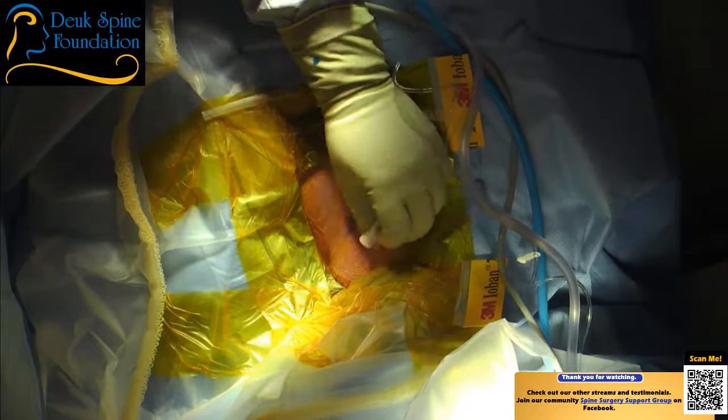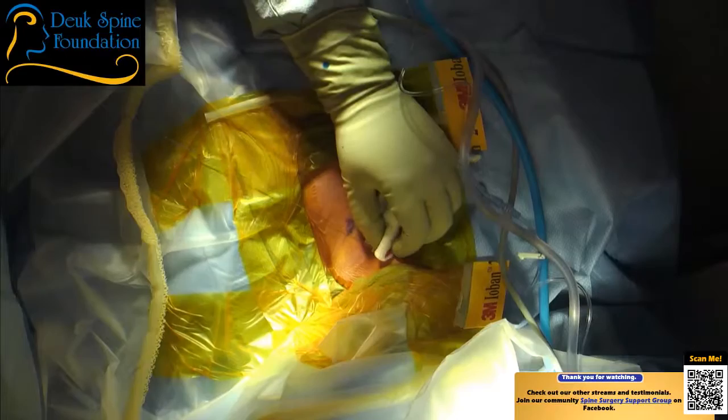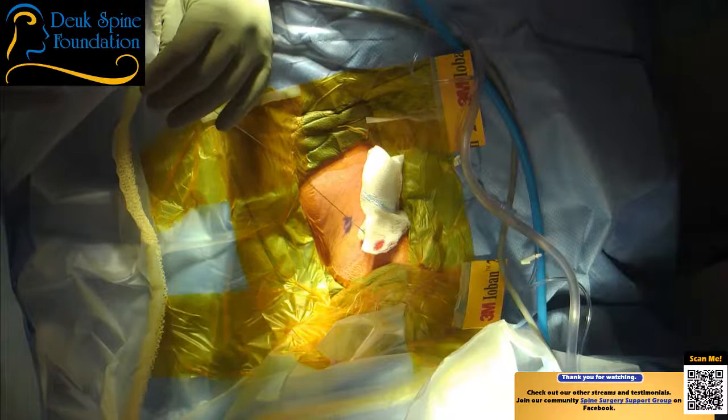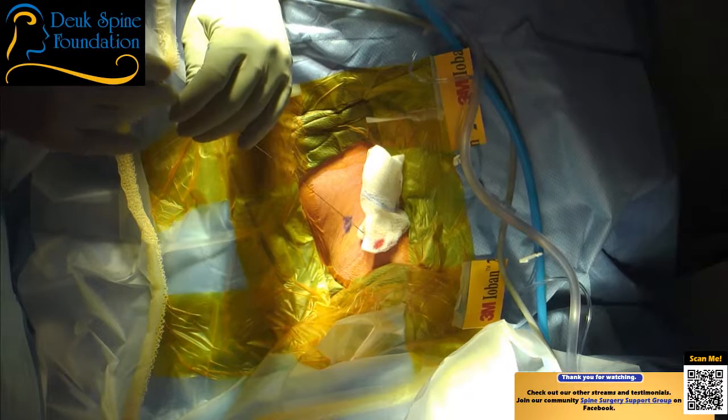The blood loss is minimal to nothing in this surgery. Currently we've lost about three drops of blood. I want to make sure the blood pressure is good, which it is. We can bring it down just a little bit. Now I'm going to bring my dilator down over the guide wire. I want to make sure nothing's moving. I don't want to advance my guide wire any further because I'm right over the spinal cord and nerve, so I'm going to be checking quite often.